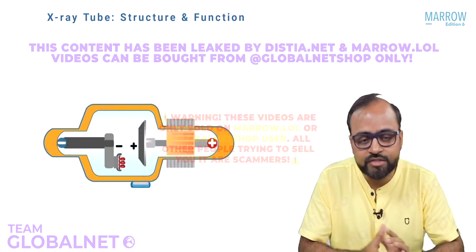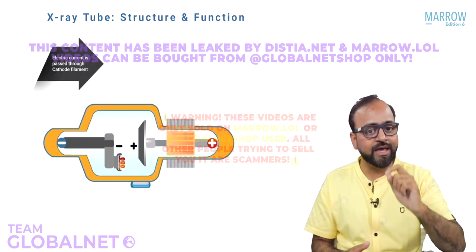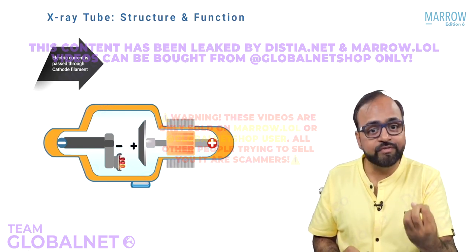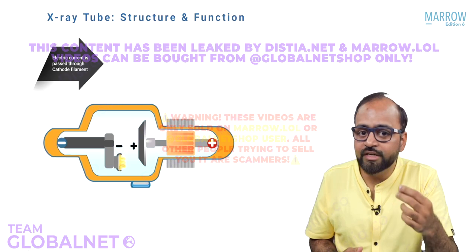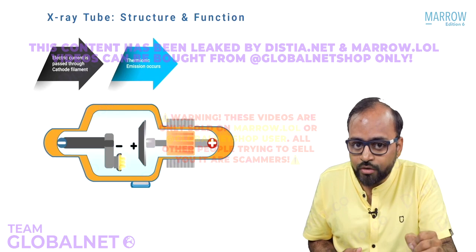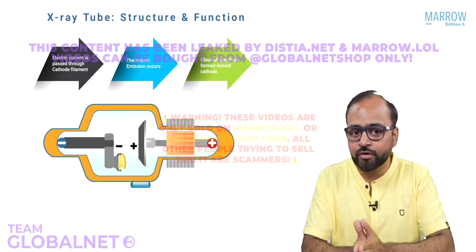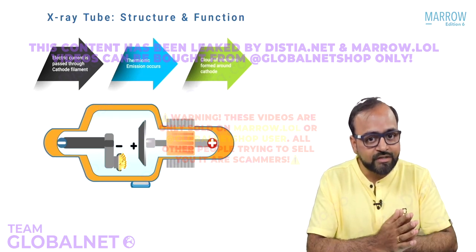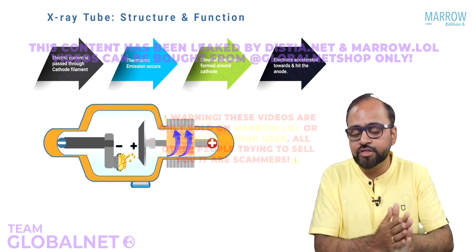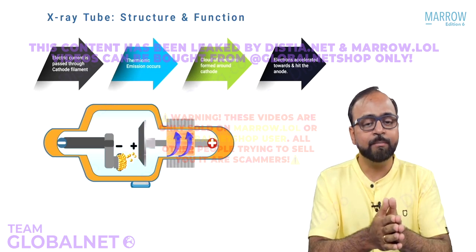When you start the X-ray tube, what happens? When you start the X-ray tube, an electric current is passed through the cathode filament. Can you see that? Yes, now this cathode filament made up of tungsten is going to get heated. When it is heated, there is thermionic emission. There will be emission of electrons which accumulate as a cloud of electrons around the cathode filament, right? These negatively charged electrons are now going to be pulled towards the positive end, that is the anode. Rather, not just pulled, they are accelerated, travel at very high velocities, and then when they go and hit the anode, this is where magic happens.